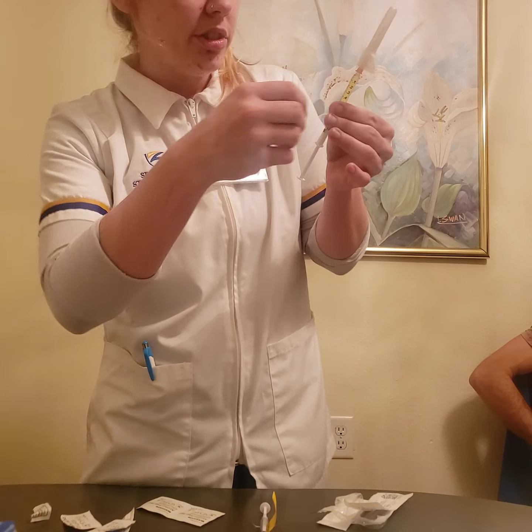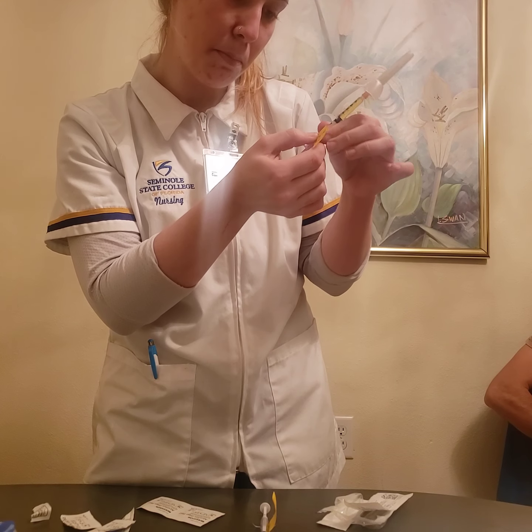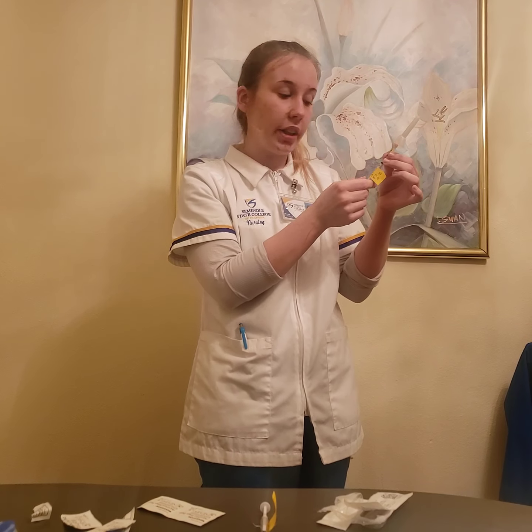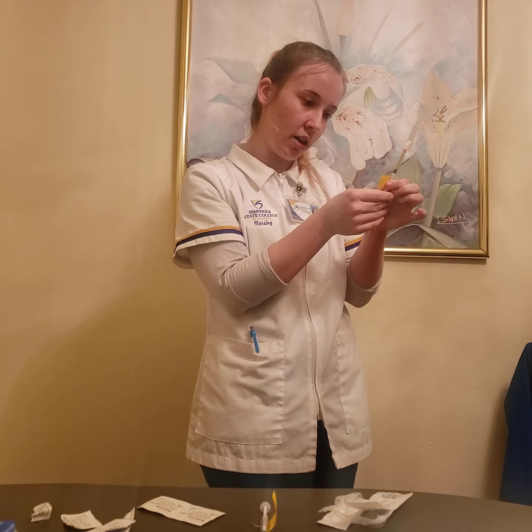So I'm going to label this one with Ms. Anna Pawlowski, my initials, date, and time. The route, I'm going to be giving the dose, which is 500 micrograms or 0.5 milliliters of B12 subcutaneous today, and it's ordered for right now for Anna Pawlowski.